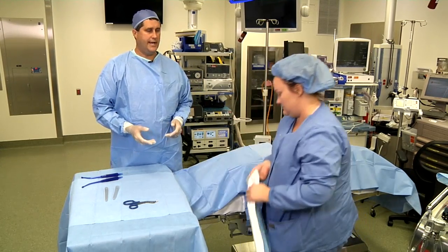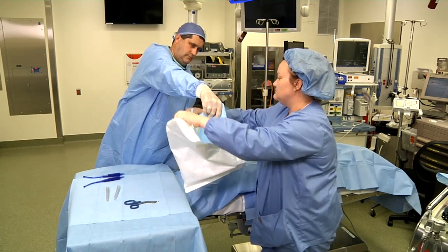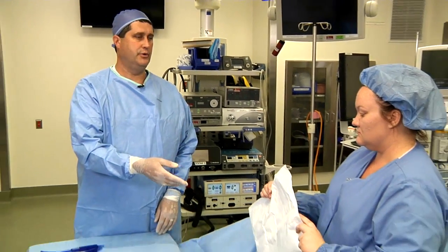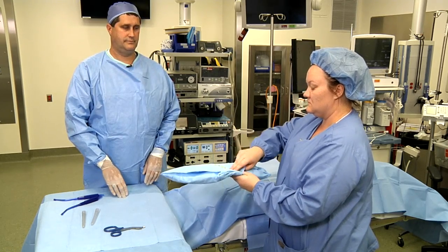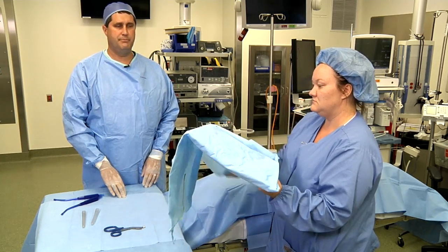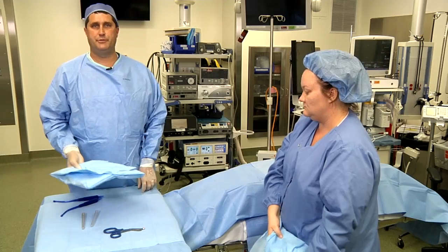The next piece to get handed up to the sterile field is the table pack. An alternative method to hand over the table pack is to have the circulator remove the blister pack and then use sterile technique to open up the blue. There are loose components inside the table pack, but they are double blue wrapped for transfer up to the sterile field.